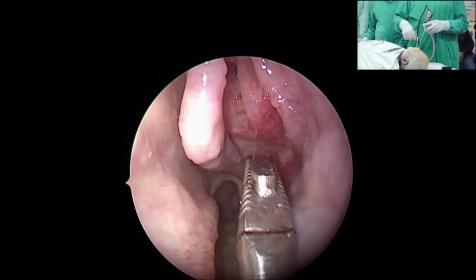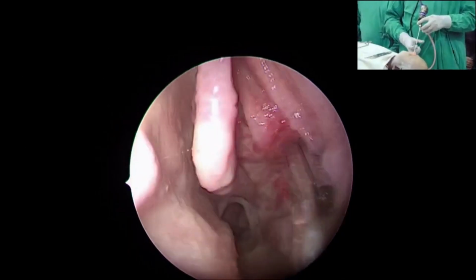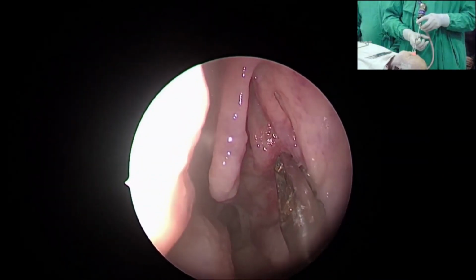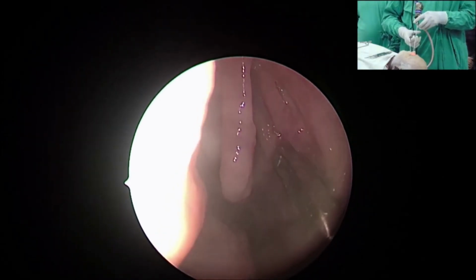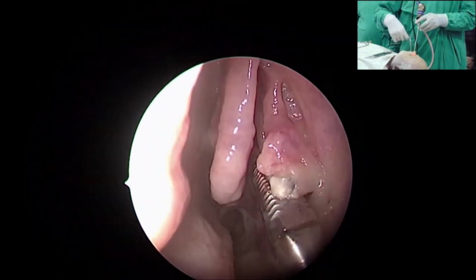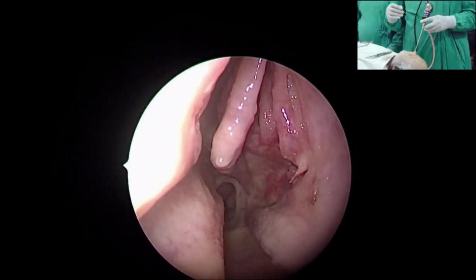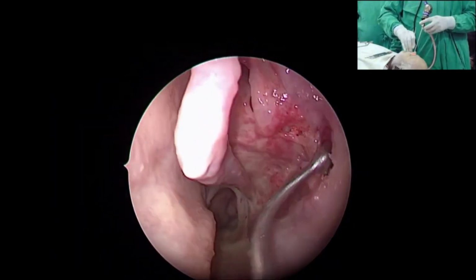So what we are using here is a reverse biting. Engage your reverse biting in the hiatus semilunaris inferioris, like this. We advocate to turn it a little down to stay away from the nasolacrimal system, as it is farther as you go down, and bite through it. Bite through it. Advance further anteriorly until you come across the hard bone. See this. The moment you come across the hard bone, you have to stop, otherwise you may bite through the nasolacrimal system.